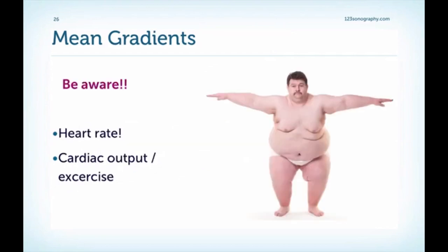But what is more important than absolute cutoff values is the fact that gradients are very strongly dependent on heart rate and in particular cardiac output. So if patients exercise or if they're, for example, just anxious during the exam, this will raise their gradients.